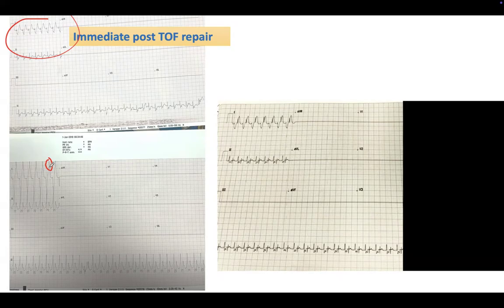Okay, so that's helpful. And then when they pace here, what are they doing? What's this, guys? Same patient. What are they doing here? There's something, PQRS, PQRS. What's happening here? Atrial pacing. Yeah, they're pacing the atrium. They're trying to override the junctional tachycardia, so they're pacing faster than the junctional tachycardia. And then you can see the QRS is identical to the QRS here.